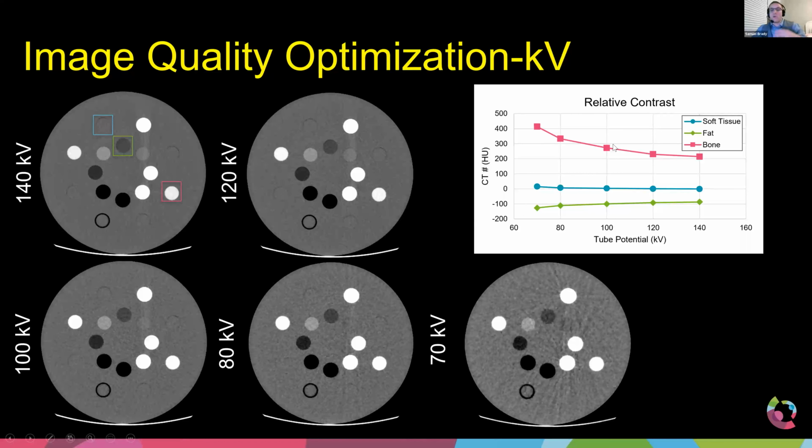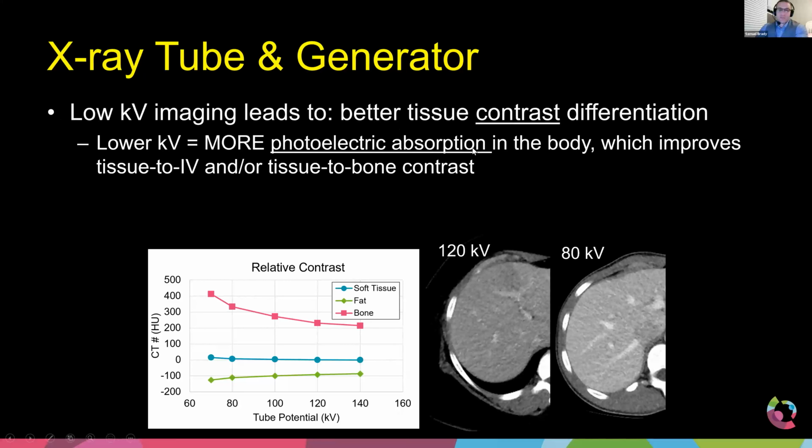And so when we set the kV, we have to set 2 things. We need to set the right mA to accompany it so we don't have this crazy enhancement of noise. And then we also have to recognize the fact that the overall intensity of the image is going to change as we change kV. So what do I mean by that?